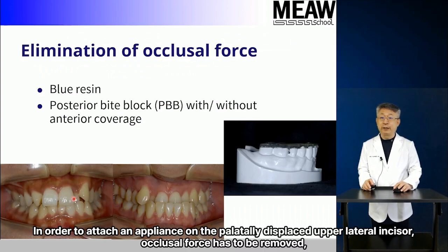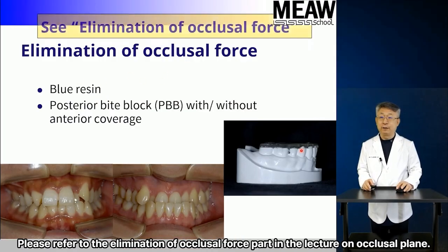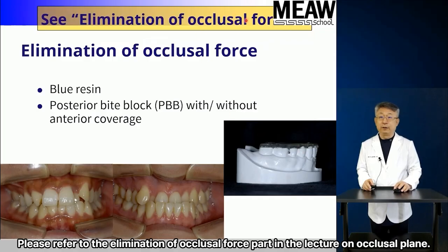In order to attach an appliance on the palatally displaced upper lateral incisor, occlusal force has to be removed, and blue resin, PBB or PBBA can be used. Please refer to the elimination of occlusal force part in the lecture on occlusal plane.